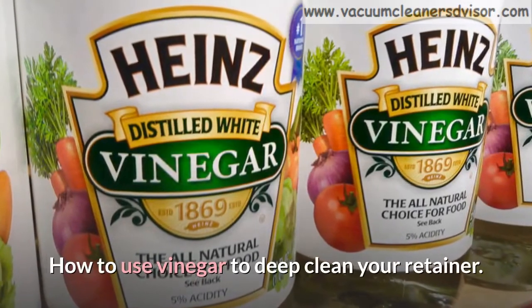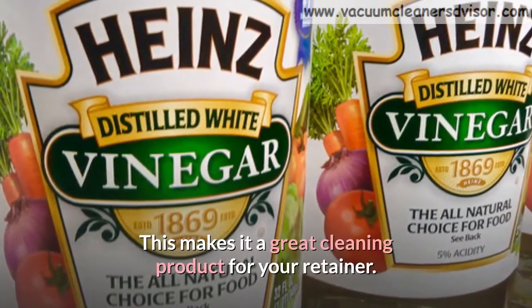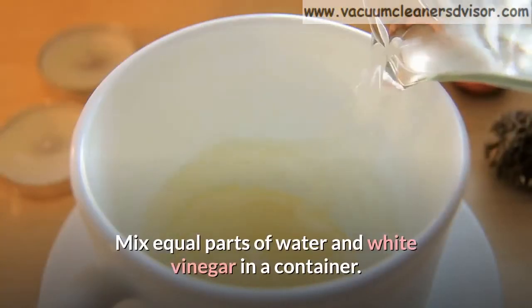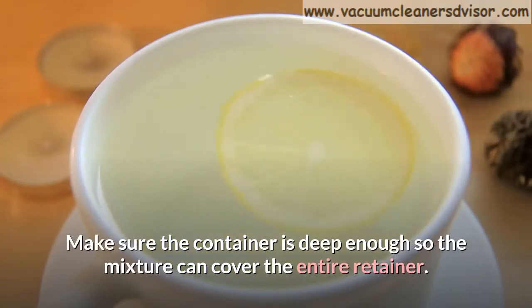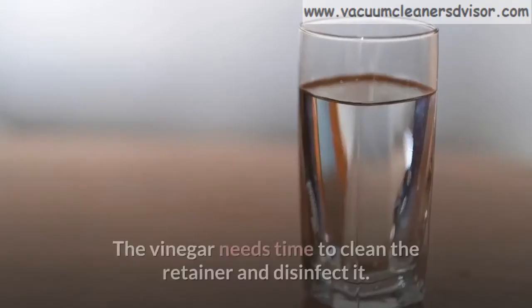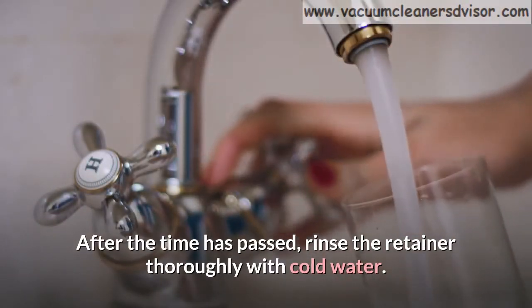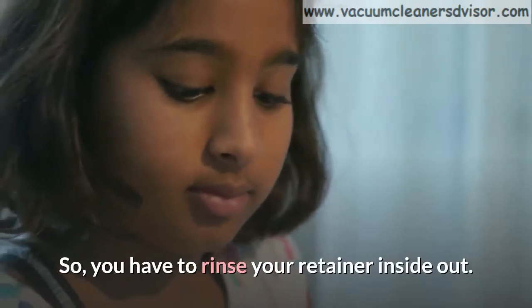How to use vinegar to deep clean your retainer. Vinegar has disinfectant properties, making it a great cleaning product for your retainer. Mix equal parts of water and white vinegar in a container. Make sure the container is deep enough so the mixture can cover the entire retainer. Then let it sit for 30 minutes. The vinegar needs time to clean and disinfect the retainer. After the time has passed, rinse the retainer thoroughly with cold water. Vinegar has a characteristic smell and taste, so you have to rinse your retainer inside out.